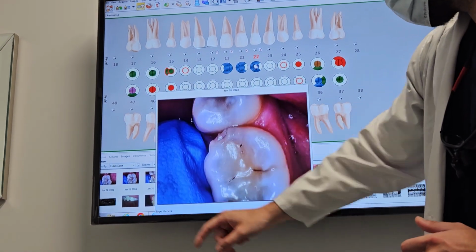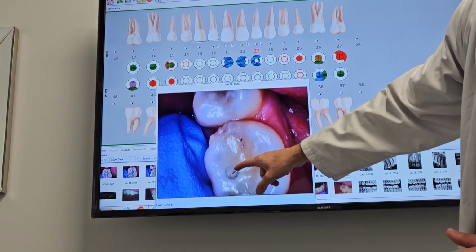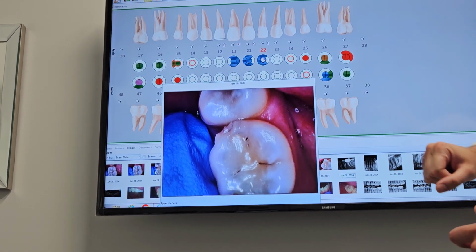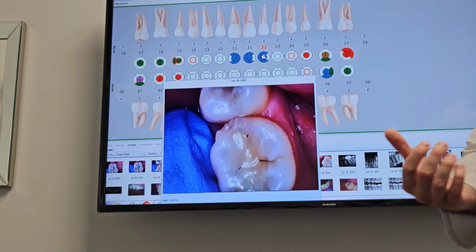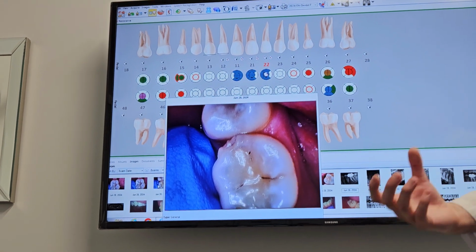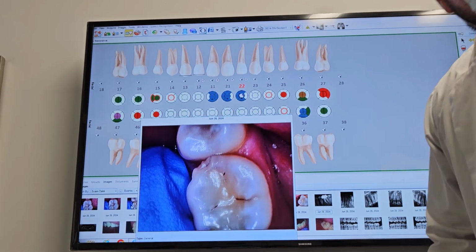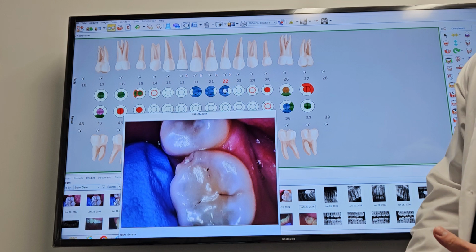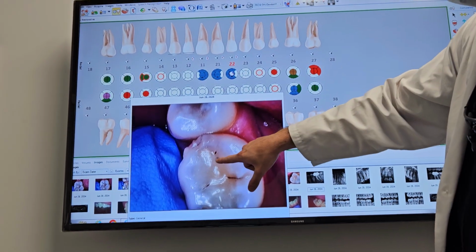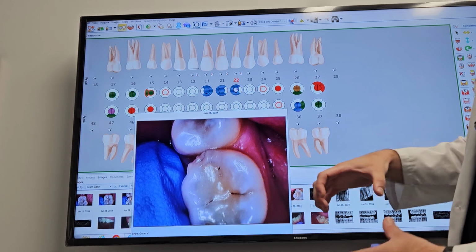And so here you can really see it. It's quite large. And even surrounding, you see that bright white around the black? Yes. It's the decalcification of the tooth. The way the bacteria eats the tooth, it needs to make it soft. It decalcifies it. How does that decalcification present? A chalky whiteness surrounding the darkened or soft, sticky area.